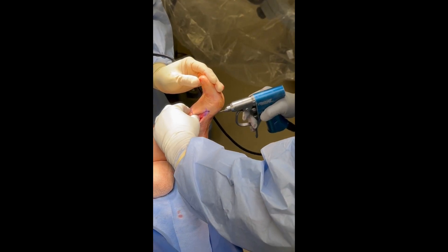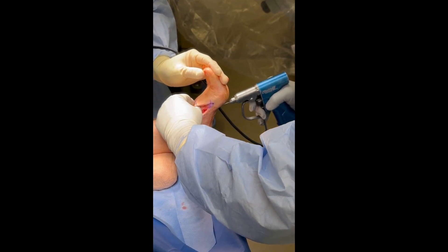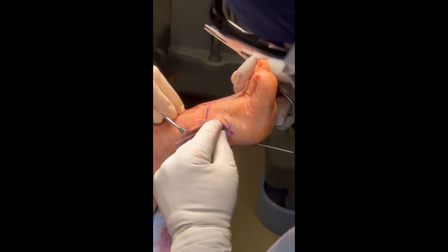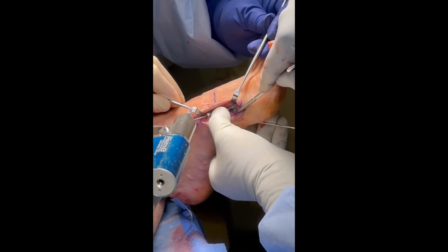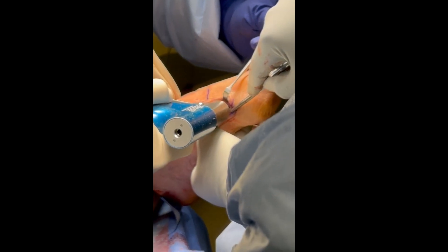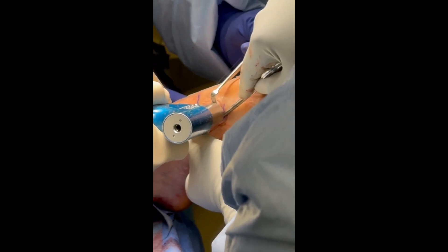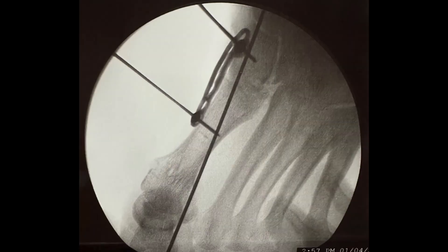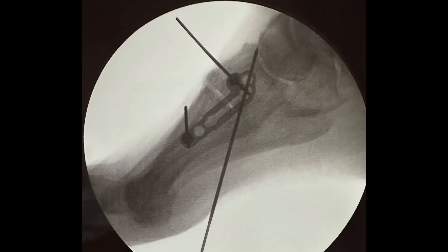We begin with reduction of the medial column. The first TMT is held reduced and provisionally fixed with a K-wire. The author performing this case prefers hybrid fixation of the first TMT, and the plate is provisionally fixed with olive wires. Other authors prefer to fix the first TMT with two orthogonal nitinol staples. Fluoroscopy is then obtained showing satisfactory reduction of the first TMT joint.